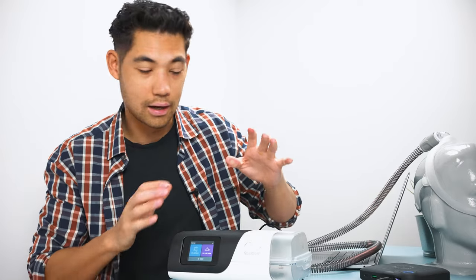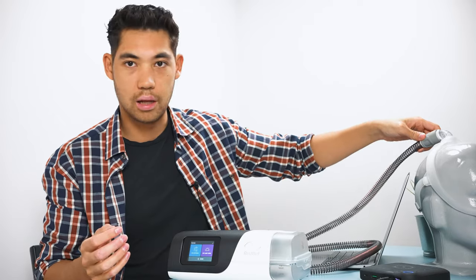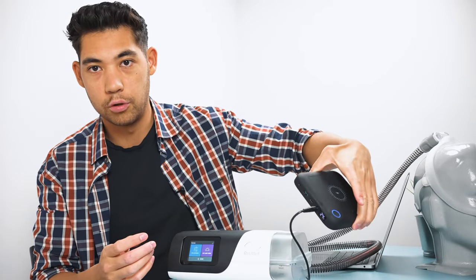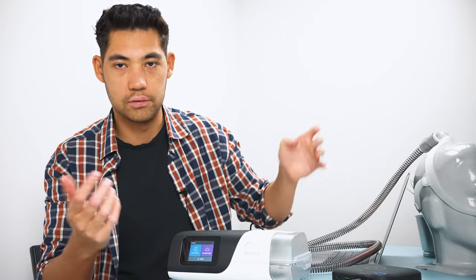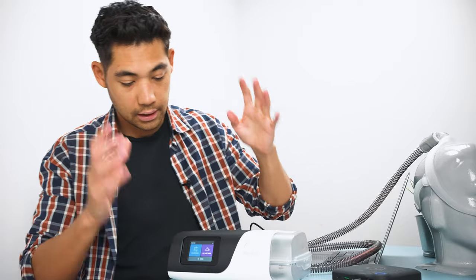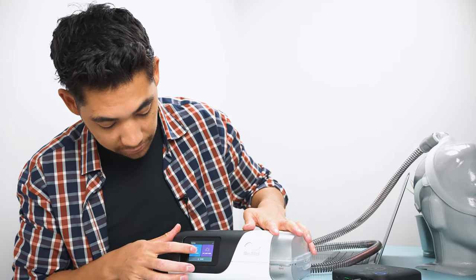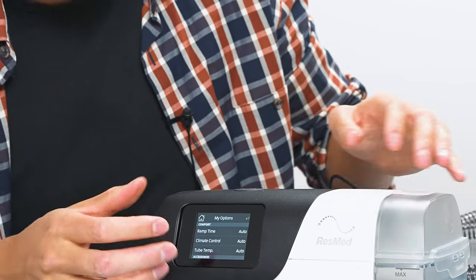All right, so we have an AirSense 11 by ResMed here, just FYI, it's connected to the climate line tubing. We have a GoBattery CPAP. GoBattery is just like the smallest travel CPAP battery you can get so it's all charged up easier for these videos. Okay, so this is what we're working with. Here we have the my options, you can see ramp time, climate control, tube temperature, etc.